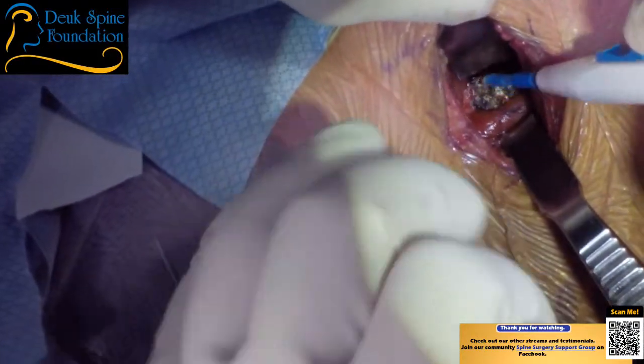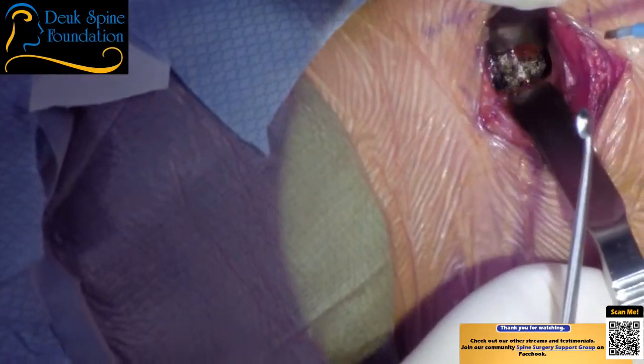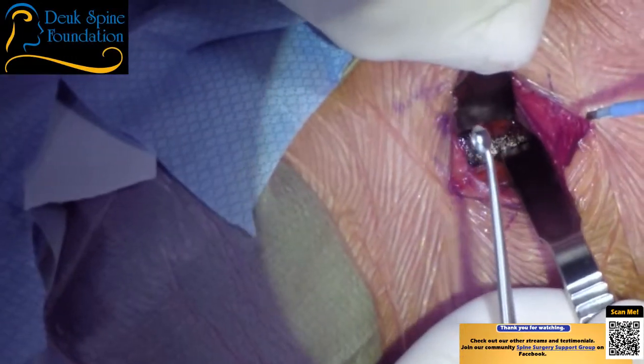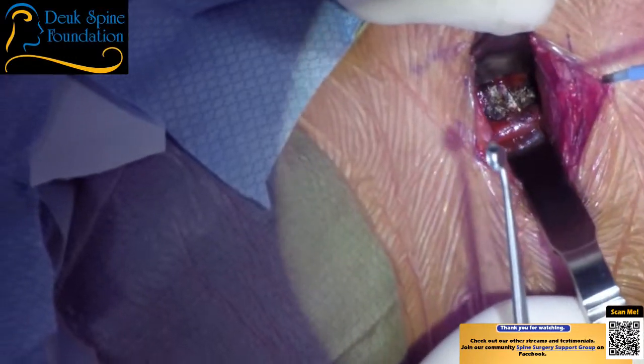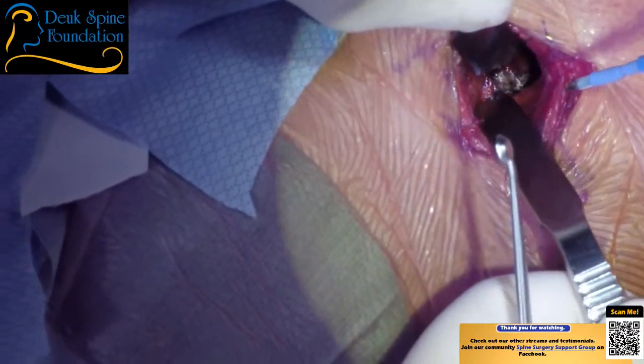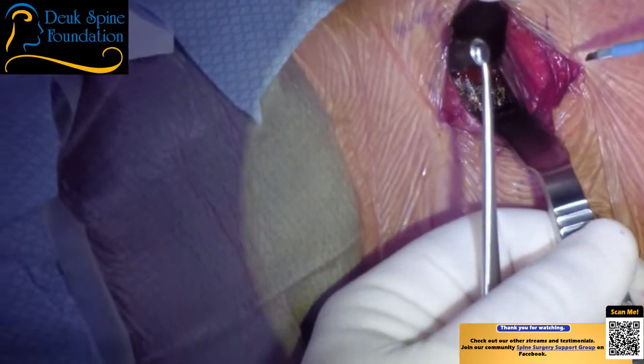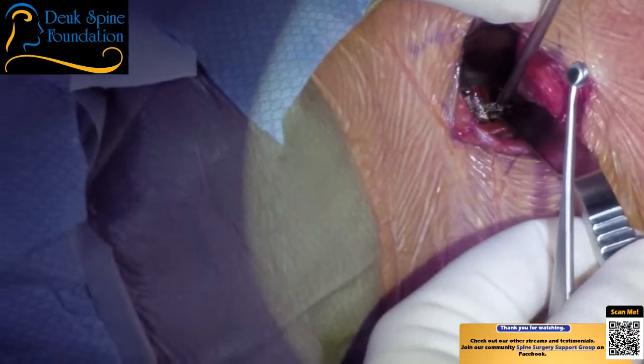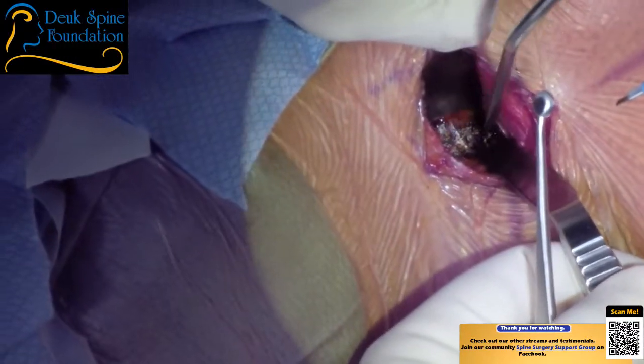Okay. So what's coming out under Luis's retractor right there is called the what? No. It's not the carotid. It's a muscle. All right? What muscle is that? Longus colli. Yeah. Longus colli muscle. That's the right side.